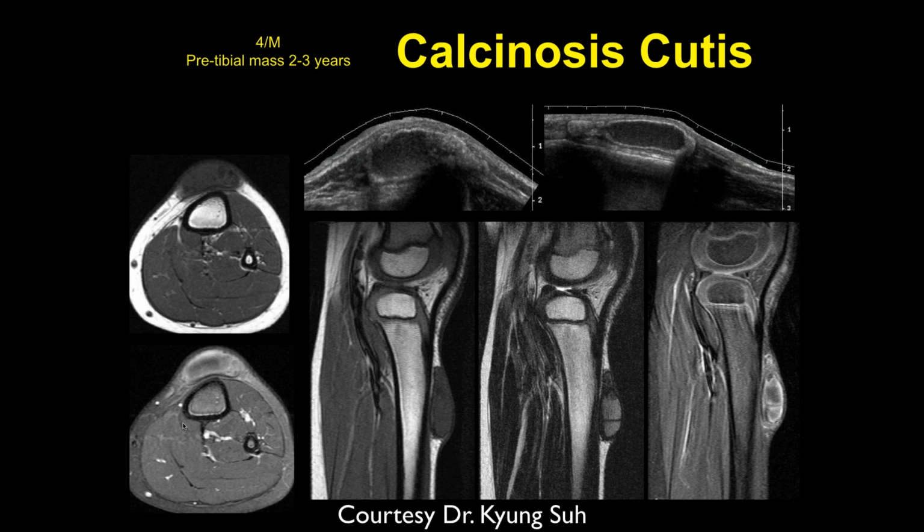You mean like a hematoma? A contusion maybe, but not Morel. This wouldn't be the acute phase. Morel-Lavallée is really the acute phase where you have fluid, separation at the deep part of the dermis, which separates from the underlying tissues, and you get hematoma formation there, and you've got blood typically in that area. This is more really within the subcutaneous fat. My guess is that these are post-traumatic, but I don't know that anyone's actually proven that.